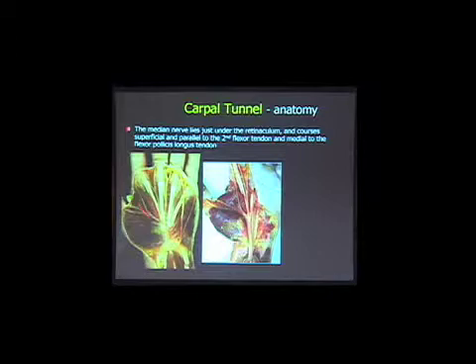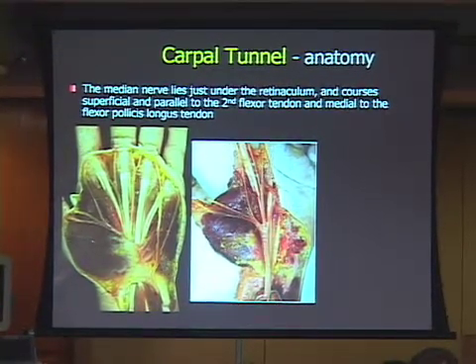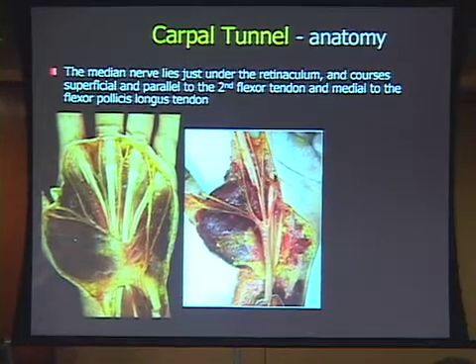And we move to nerves just to discuss the most important one, the median nerve. And we addressed the carpal tunnel before, and this is the carpal tunnel. You see during the dissection, the superficial tissues were removed, and you see the tendons as they diverge distal to the carpal tunnel. This is the position of the retinaculum, and after removal of the retinaculum, you see the median nerve and its divisional branches.